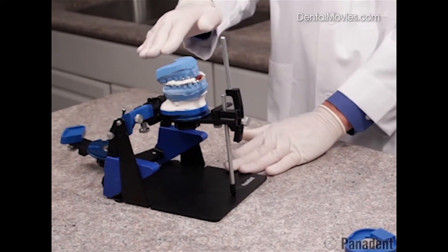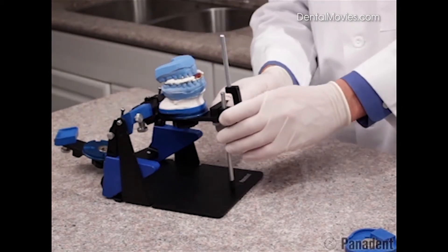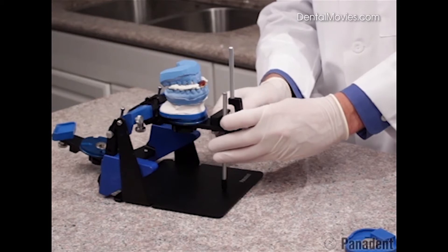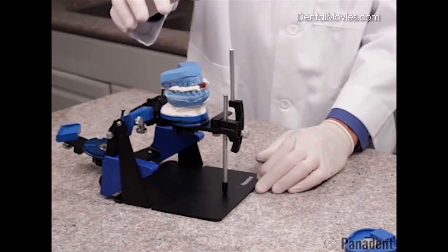And many times you have a curve of Spee here where the casts are canted downward. And so we can actually adjust the front of the articulator down to level that cast so the plaster will actually stay in place during the mandibular mounting procedures.